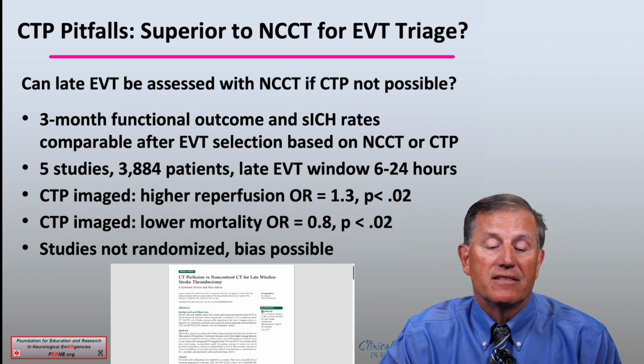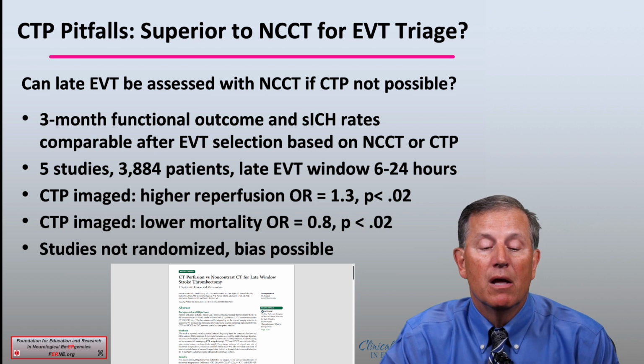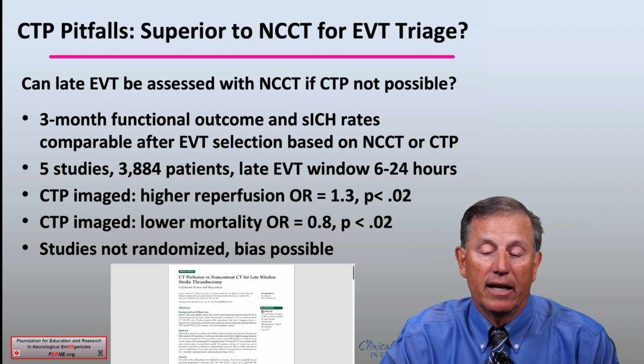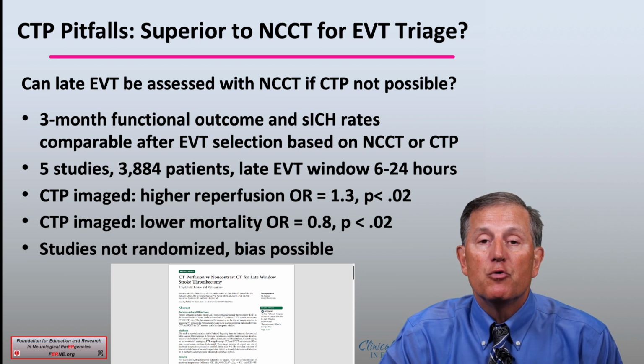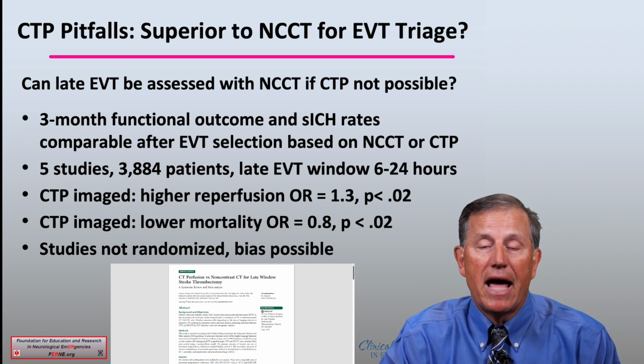It looked at 5 studies, almost 4,000 patients, and it looked at the late EVT window of 6 to 24 hours. And in fact, the CTP image did have higher reperfusion likelihood and a lower mortality. Odds ratios listed here. What this suggests is that if you do use CT perfusion, you are more likely to have higher reperfusion and lower mortality when referring for EVT.